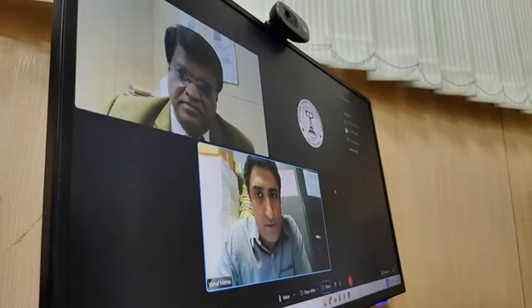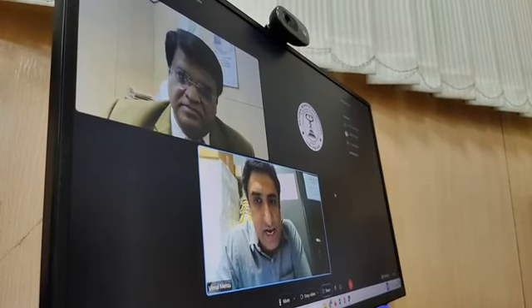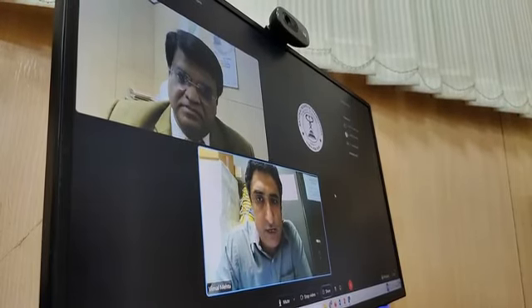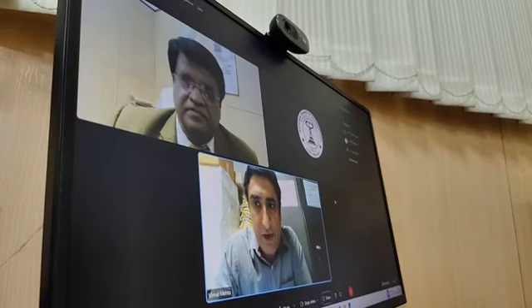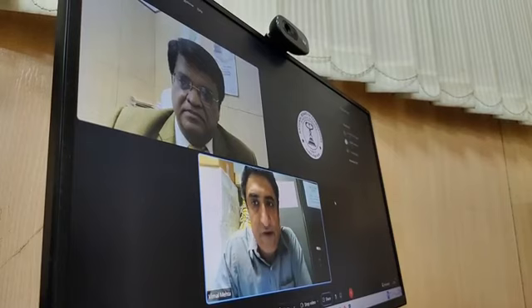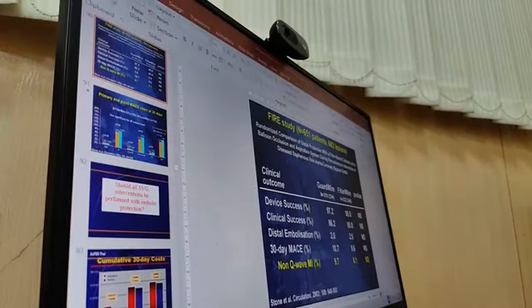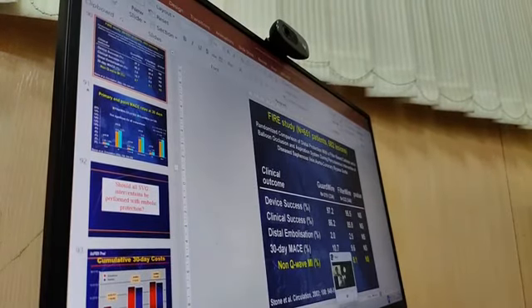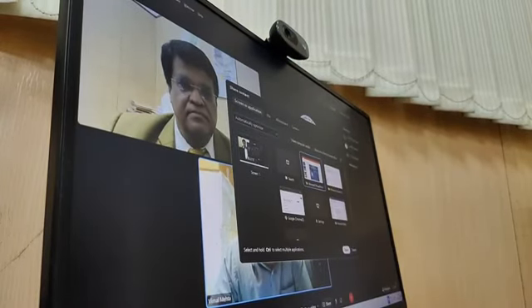So, a lot of thrombus was removed. There was some TIMI 1 flow, a trickle, but it was loaded with thrombus, chunks, cholesterol and everything. So, how do we approach such patients? That is one question. And then somebody is asking, how will a proximal protection device protect against distal embolization? We have heard about proximal protection in carotid angioplasty, the MOMA device and all, but how will it be effective in this kind of scenario?